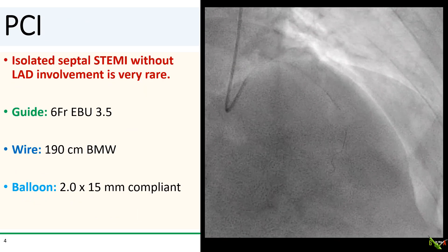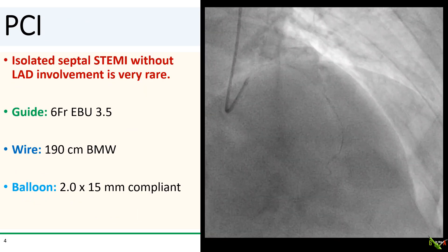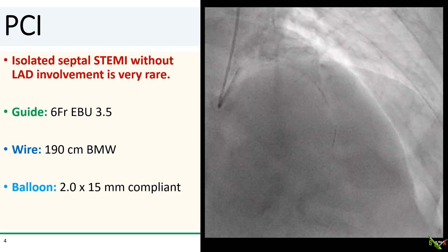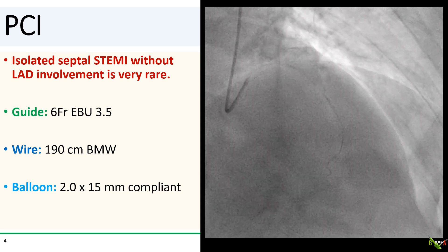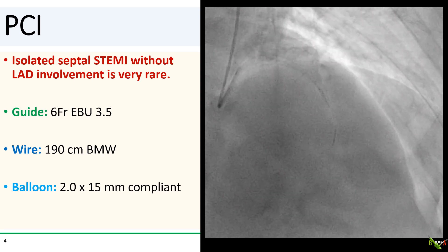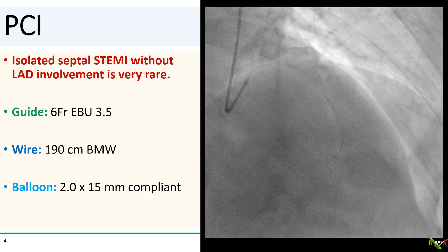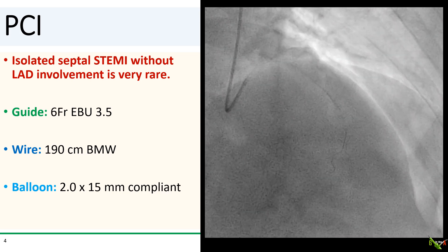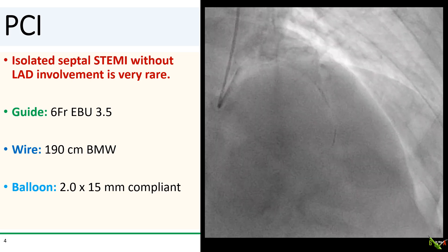Initially, I actually thought that this might have been a twin LAD, because isolated septal STEMI without LAD involvement is actually quite rare. But given his ST elevations and the active chest pain, what I had to do was a no-brainer.